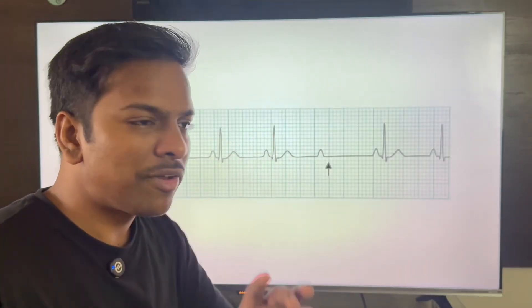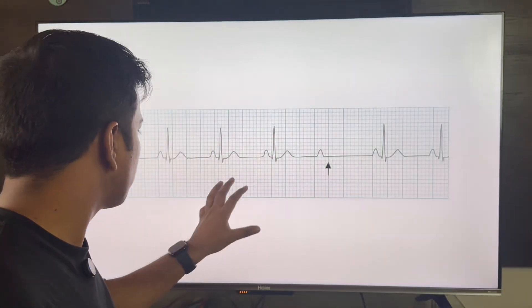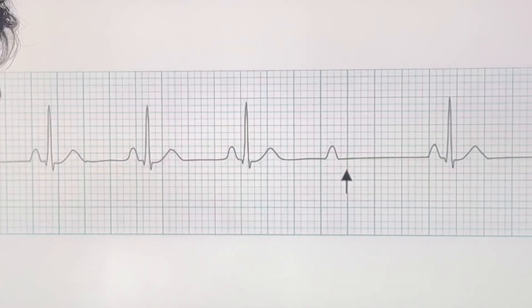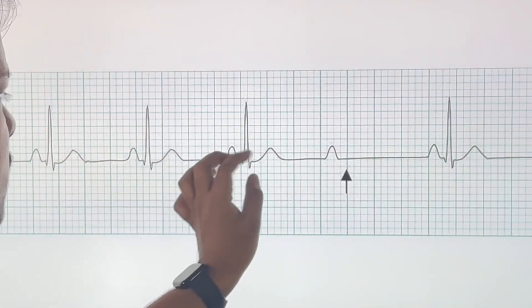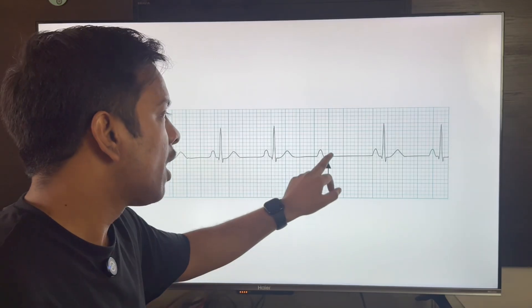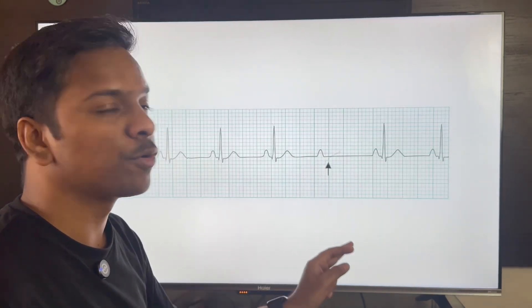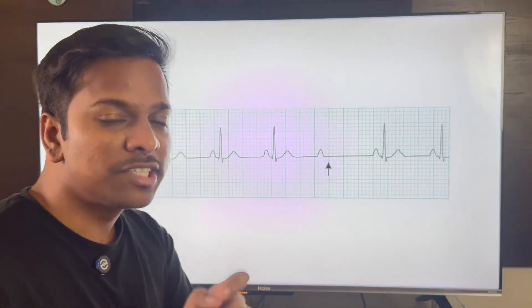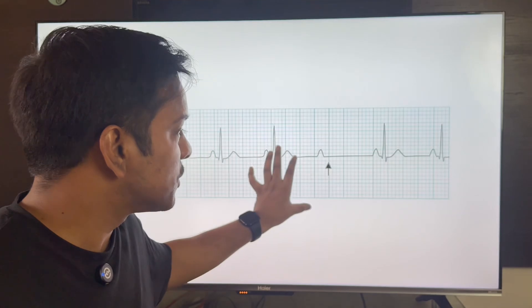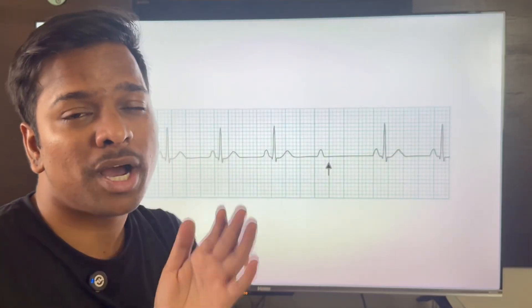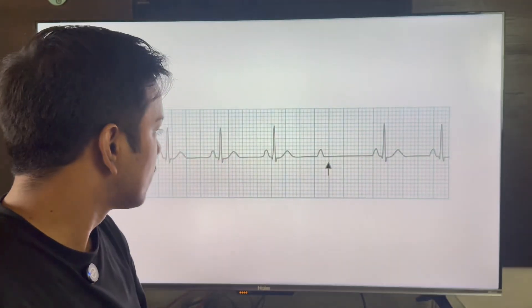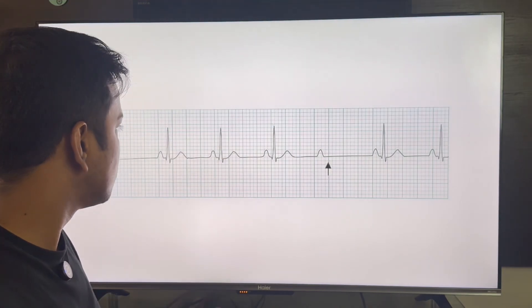In this ECG, the PR interval is quite short and constant, but at some point after a P wave, the QRS is not followed. This is Mobitz Type 2 heart block. In this patient there is a definite indication — you should do either a temporary pacing or permanent pacing.